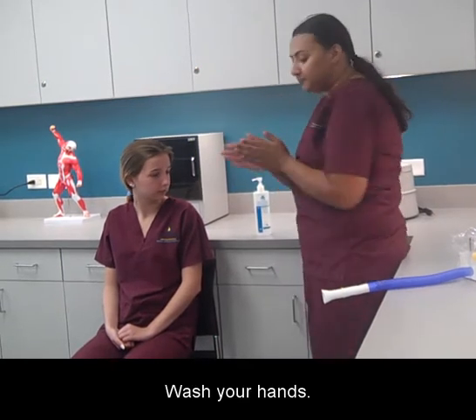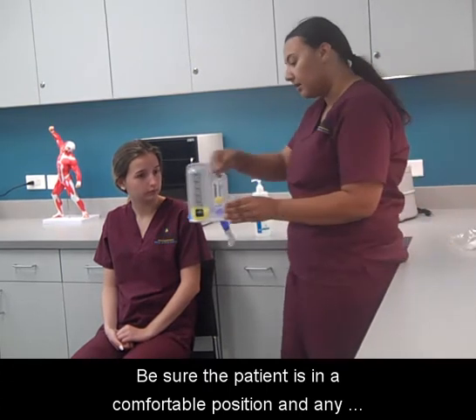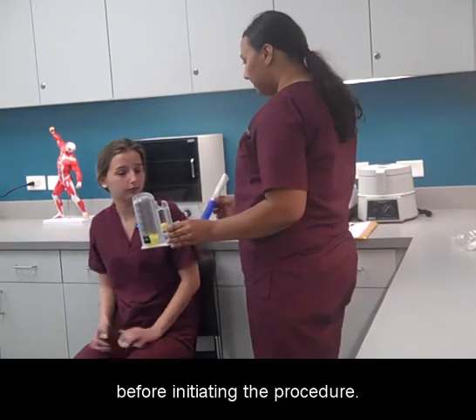Wash your hands. Be sure the patient is in a comfortable position and any restrictive clothing such as a tie or collar is loosened before initiating the procedure.